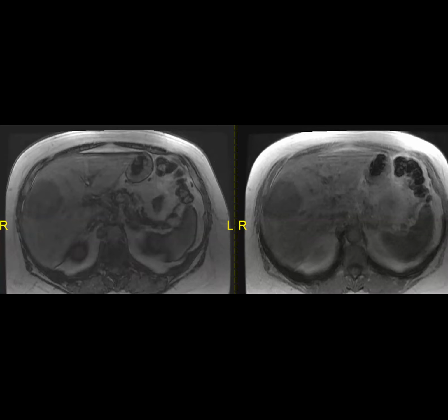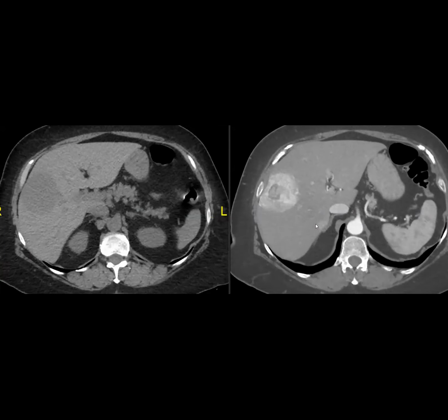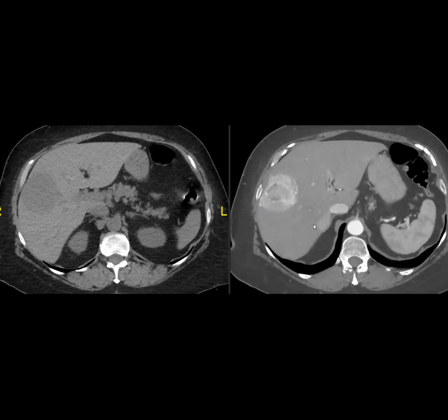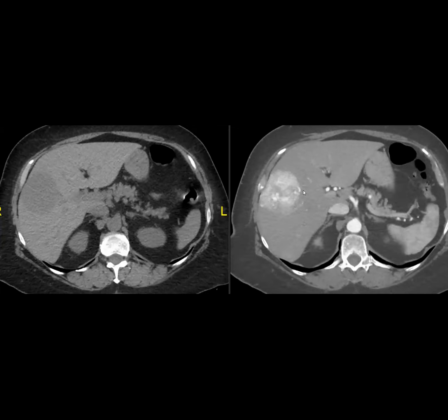I was asking for the in and out because I was thinking angiomyolipoma with all the vessels, but I still think it's concerning. Yeah, I don't like any of this one or the prior because FNHs and adenomas tend to be less busy. You do not want to call this an FNH. This is too aggressive. When you see vessels like this, an FNH doesn't restrict like that.